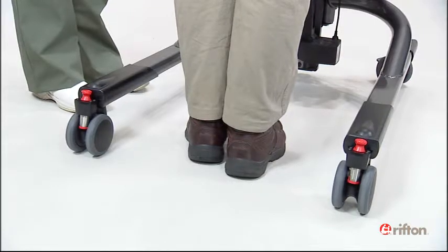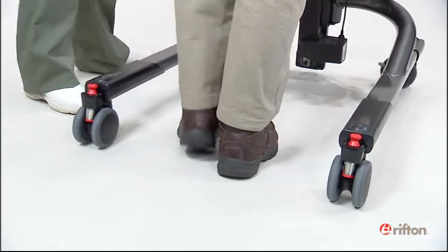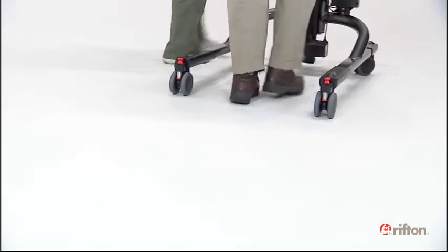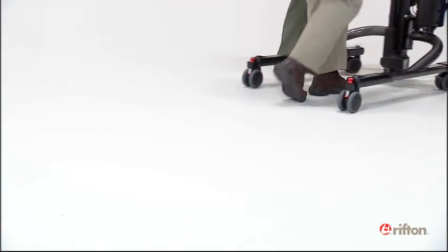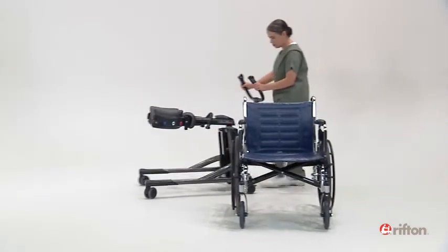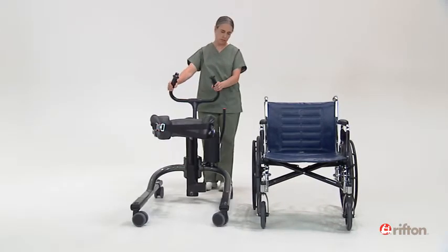When using the tram for gait training, most clients will find steering easier with one or both of the rear casters locked directionally. Locking only a front caster can be helpful when maneuvering and relocating an empty tram.